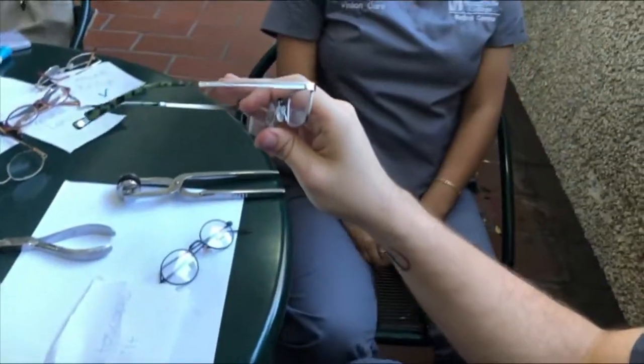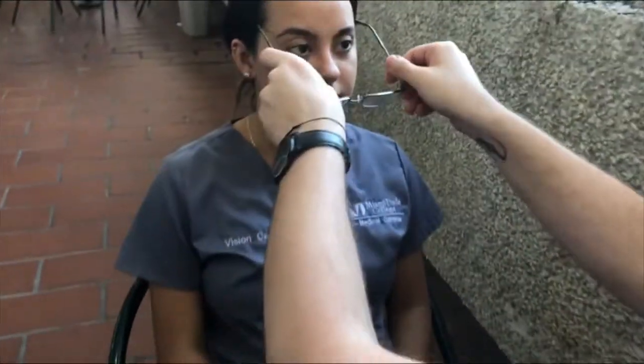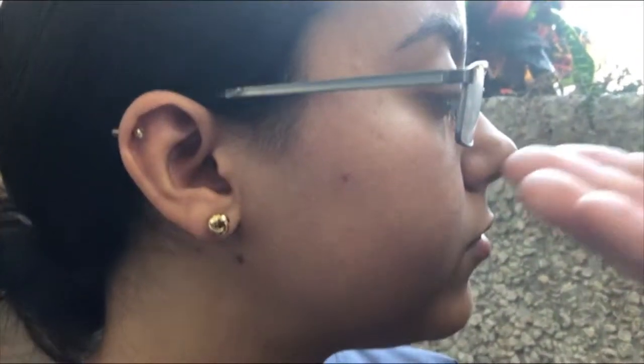Our next misalignment that we're going to talk about is panoscopic tilt. When we put this frame on the patient, when you look at it from the side, you can see that the bottom of the frame is closer towards the cheeks.